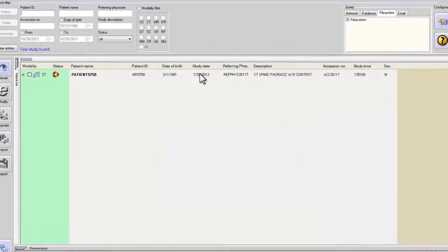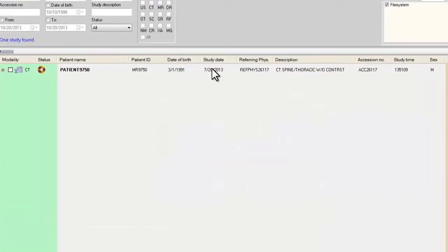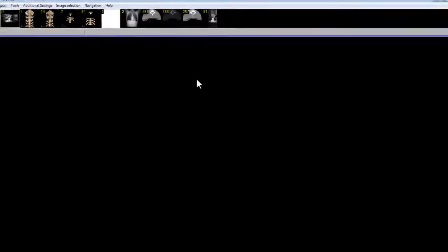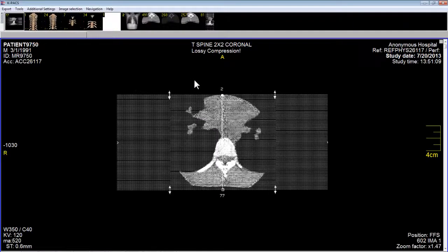Now I will click on the patient, 9750, to load the images. And here we have it. We have loaded the patient that we want to study first.